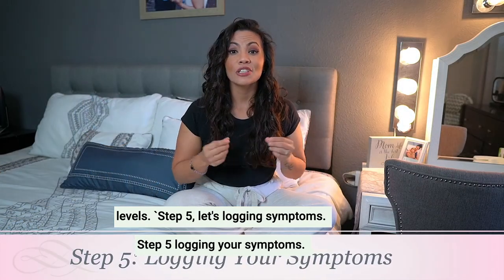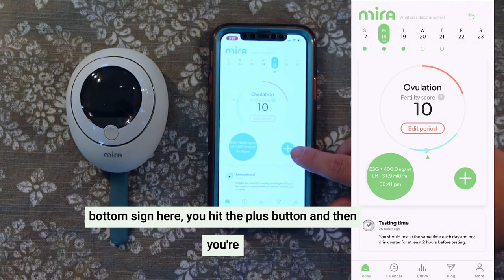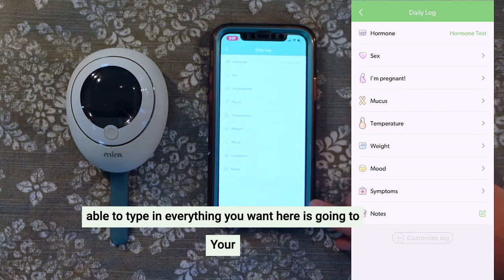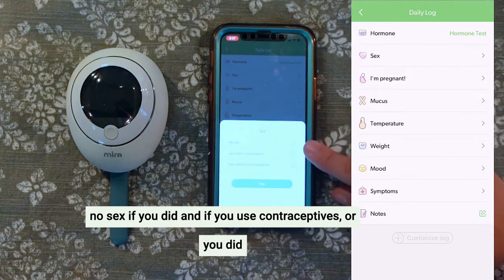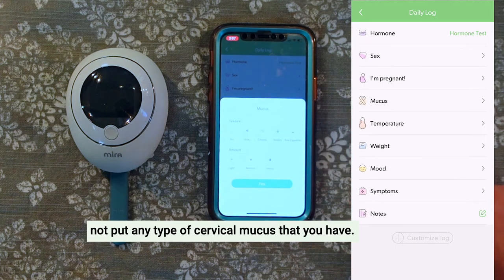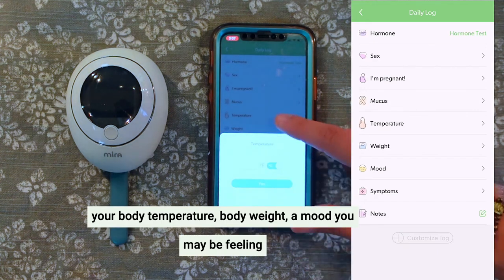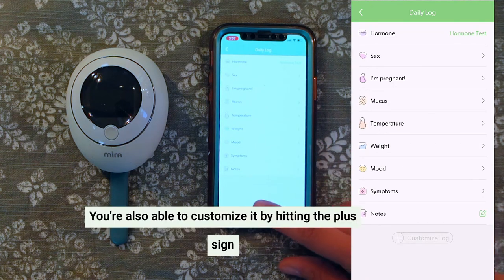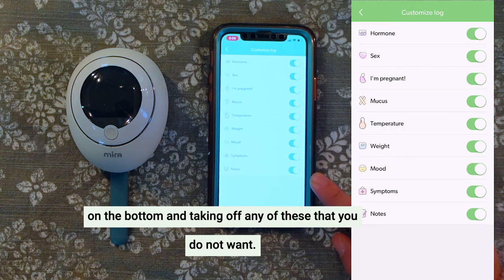Step five: let's log our symptoms. If you want to log your symptoms, you go to the bottom icon here, hit the plus button, and then you're able to type in everything you want. It will show your hormone testing. You can put in whether you had sex or not and whether you used contraceptives. You can put in any type of cervical mucus, your body temperature, body weight, any mood you may be feeling, symptoms, and notes. You're also able to customize it by hitting the plus sign on the bottom and removing any fields you do not want.